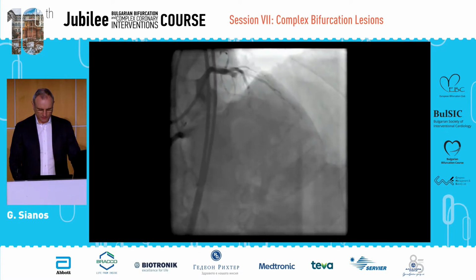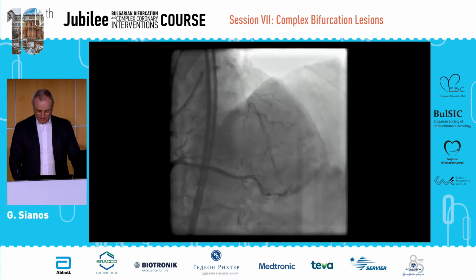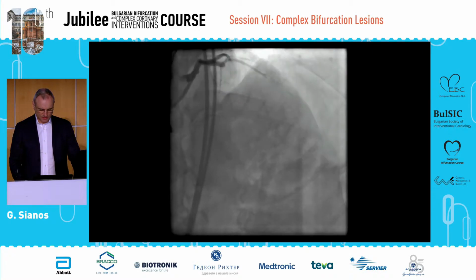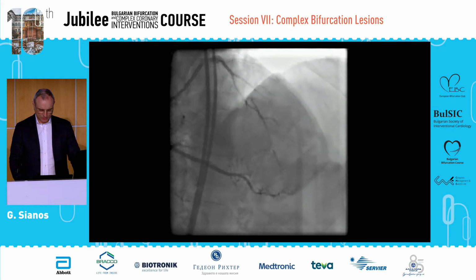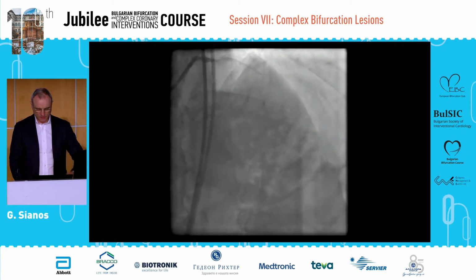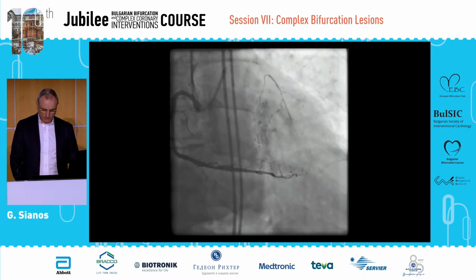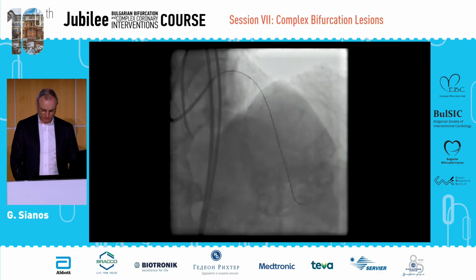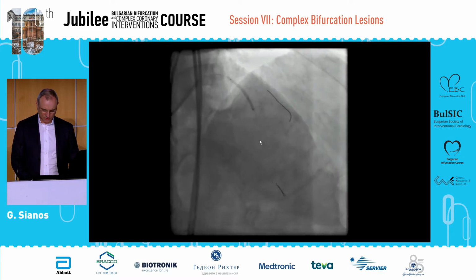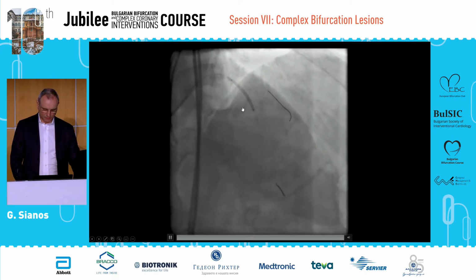Second case, this was a physician that came recently. He had worsening angina. He was catheterized in another hospital and he presented with this CTO. Many times when you see these, it was very easy antegrade access with a Gaia wire. And after the predilatation, you see here a small glimpse of contrast coming into the middle of the balloon.